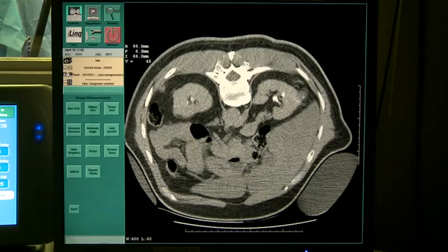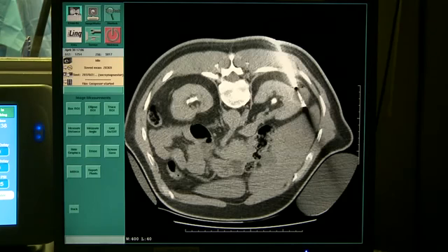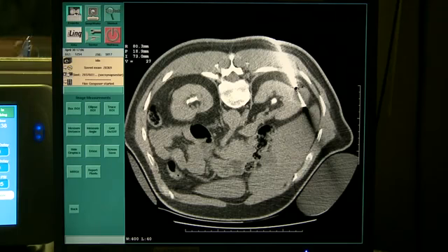This is the top of the lesion with tumor. Next cut down, we have a nicely centered cryo probe. Here, again, the active gate is from here to here. Parenthetically, it's interesting to note that the renal lesions remain low attenuating for a really long time. I think most of us don't really appreciate that because in the diagnostic realm we never scan so late. But if you have trouble seeing a lesion, it's not like a hepatoma that's going to wink at you and go away.